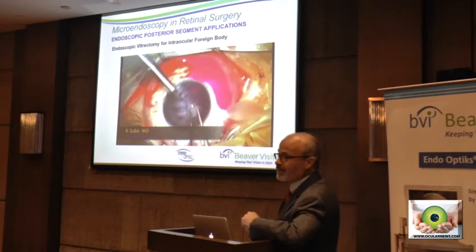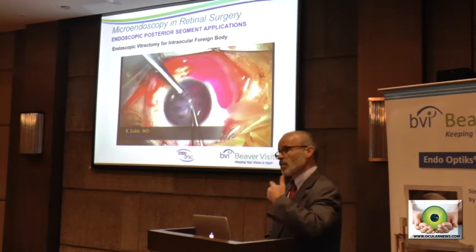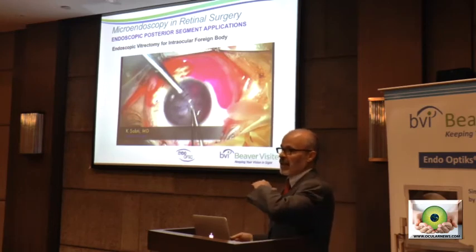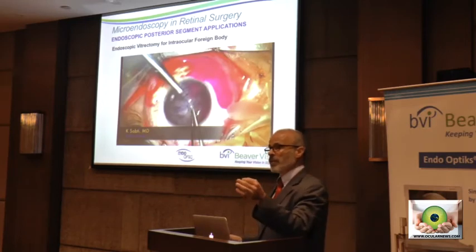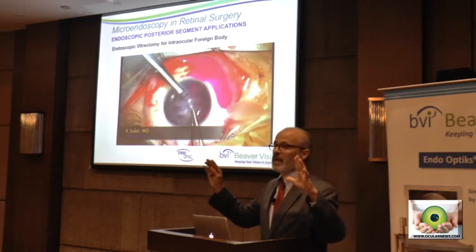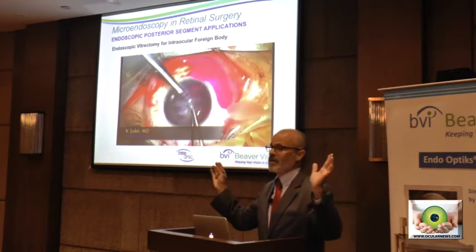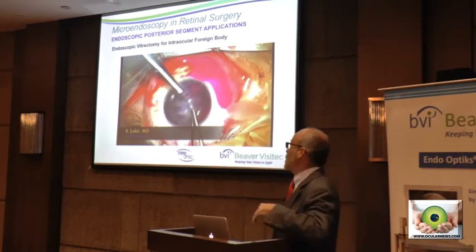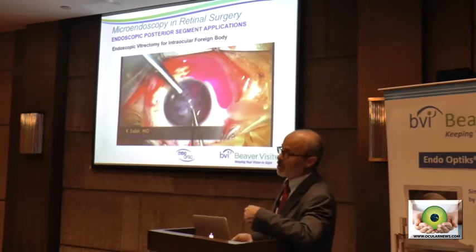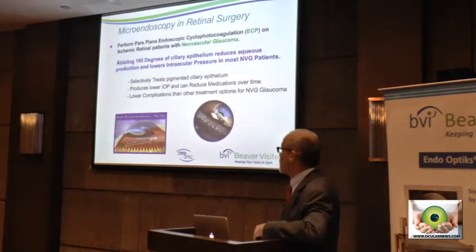He obviously had a corneal graft subsequently. Anyway, so sparing the keratoprosthesis with the endoscope: in a severe trauma case with hazy media, you're able to go through a 23-gauge trocar, have a panoramic view of the retina, and determine whether surgery is even indicated. Very often you can spare the patient any more trauma. There's really not much you can do. You can dispense with the keratoprosthesis, and so just fewer interventions by going in directly.